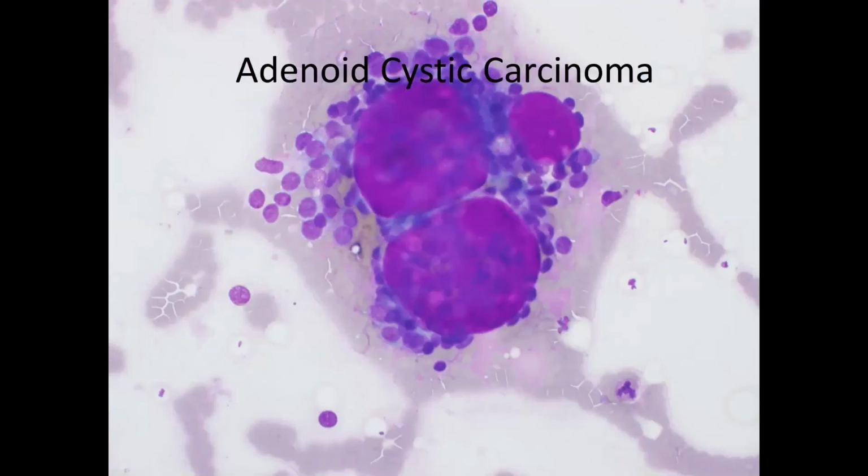The stromal material is very sharply defined, and it does not have any internal structure. So again, these hyaline globules, gumdrops as DeMay calls them, are just very sharply defined balls of stromal material. You can see these in other tumor types besides adenoid cystic carcinoma. For my money, the larger these stromal balls are, the more believable it is to me. So the more there are, the larger they are, the more believable it is.